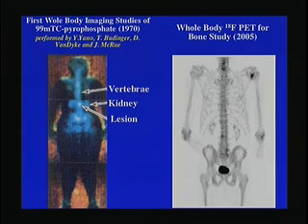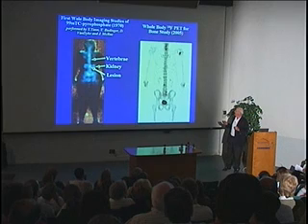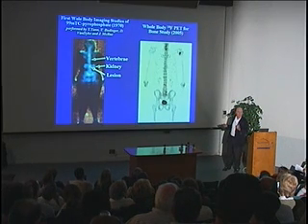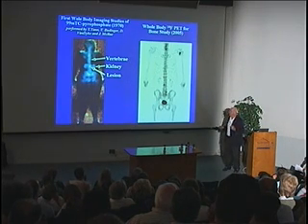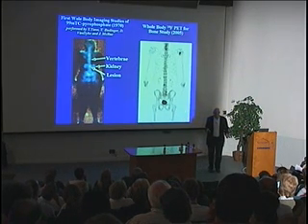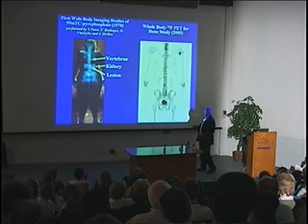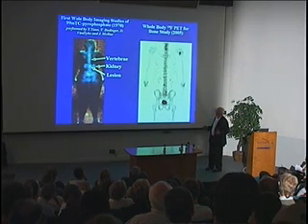That's right. So if I told you that this person was a left-handed tennis player, what would you think? Could be arthritis. And this could be either metastases or lumbar injury. So this patient has cervical injury, lumbar injuries, and was trying to play tennis, and not very well. As you can see, he was somewhat strained. He's still around, by the way.